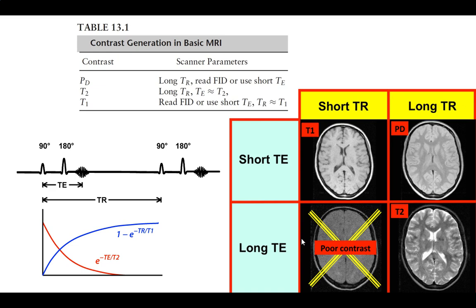So for the echo time on that, it's already had a loss, so we want that to be fairly short. We also want the TR to be short because we're kicking it over, and I'll show you where. We want a decent contrast between these. If we wait too long, we lose all our contrast difference on that second kick down. Nobody here is showing the two kicks because it's the only one that takes two kicks. You just have to remember it. This one takes two kicks. But it's got to be short on those. And the main reason, in essence, is that our recovery time is going to cover this one when it comes in.